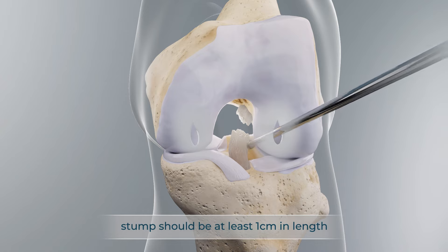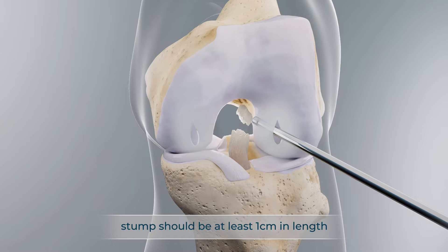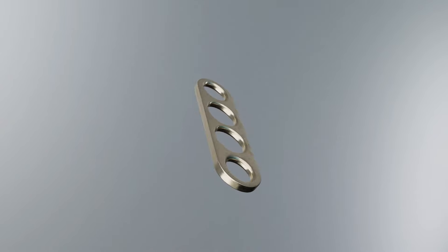Assess the tibial ACL stump for adequate length and quality to ensure it can hold a non-strangulating suture. The femoral fixation button should be prepared with cinch and toggle sutures.